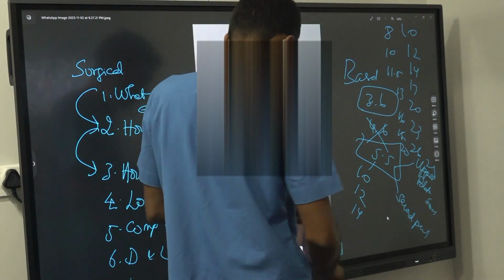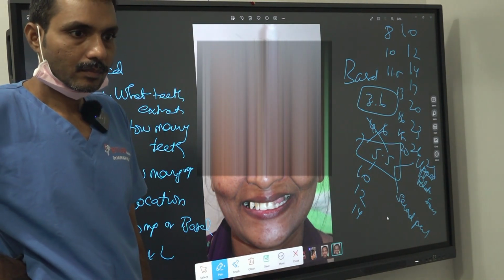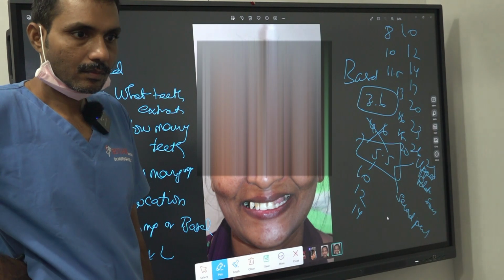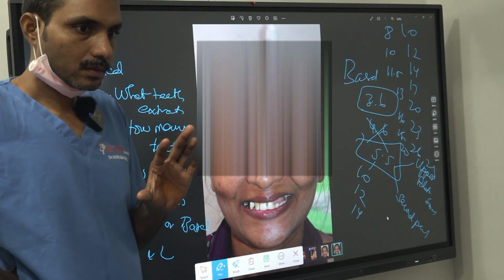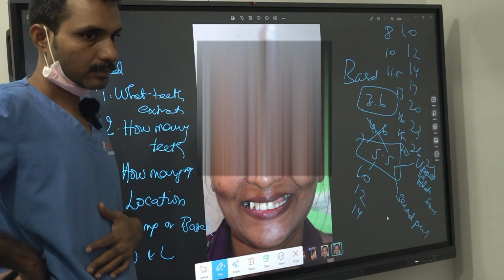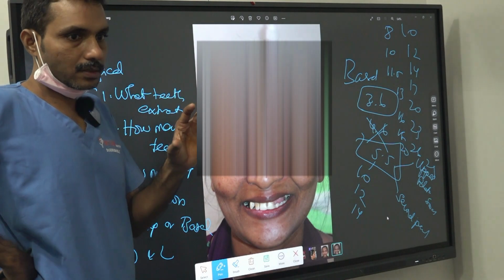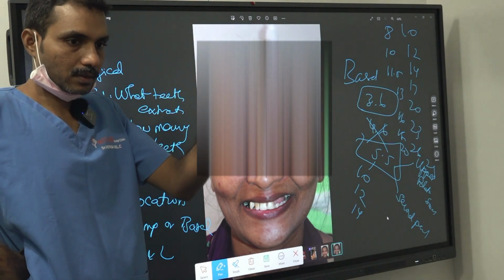Mostly they select a 10 size implant for length. Of course, if it is 10 in compression, it is measured from the threaded part. If it is basal, it includes the neck part.